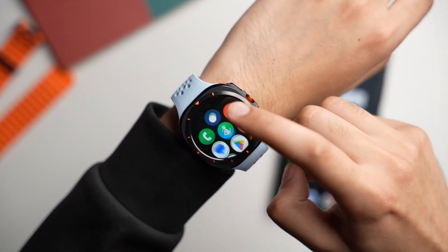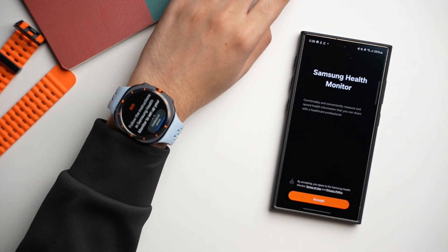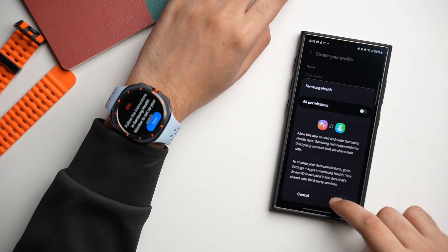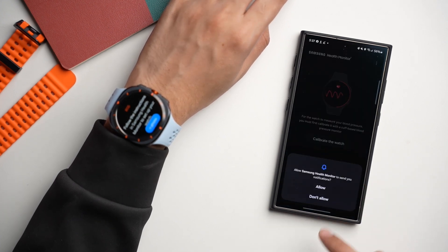Now open this newly installed SHM app on your Galaxy Watch, and it will also open the SHMOD app on your Galaxy phone. Just go through the rest of the setup process and enter the required information.